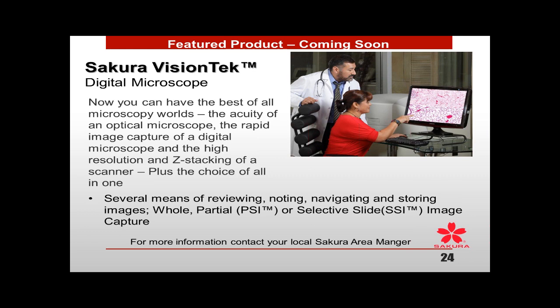Thank you. The next question is, what part of validation study is needed for this technology? Is there a framework? I would go to the Digital Pathology Association or even to CAP, where there are recommendations for doing your validation. If you're using an FDA-approved algorithm, you already have those guidelines, but as you develop new processes that don't particularly work with a diagnostic algorithm, the medical director, laboratory director, and your accrediting associations will really decide what kind of validation protocol you will need.